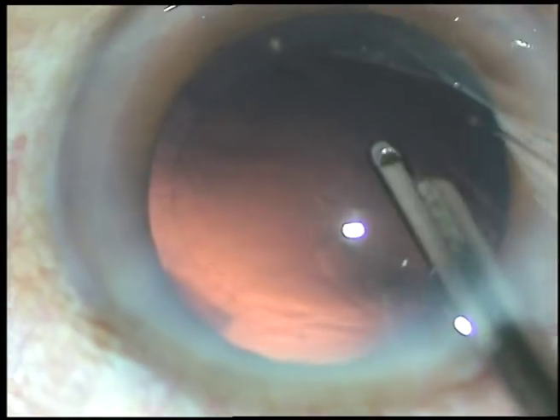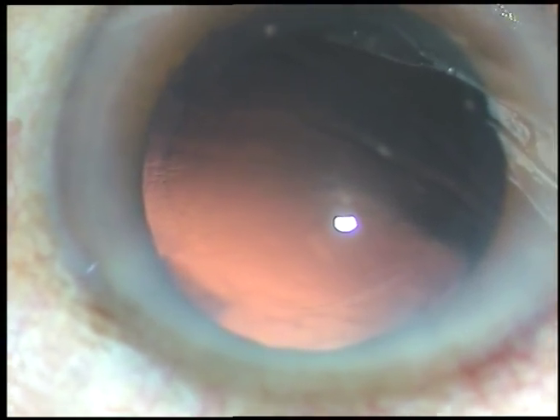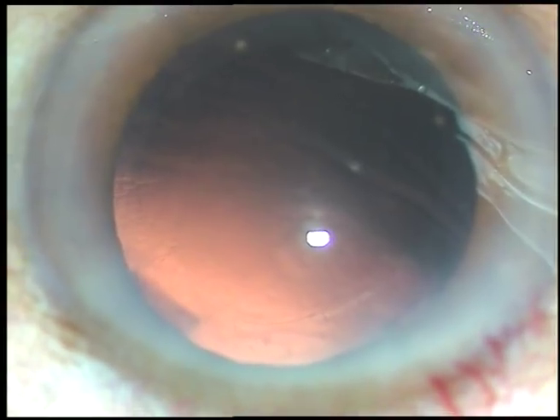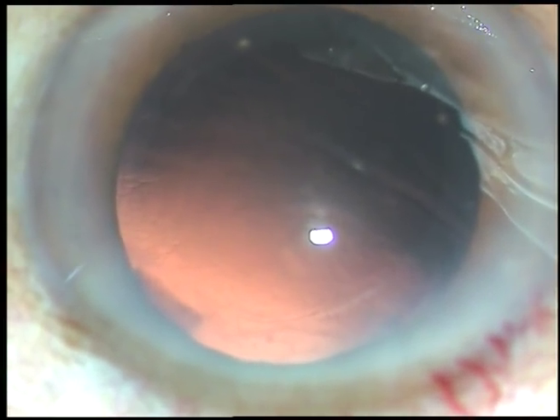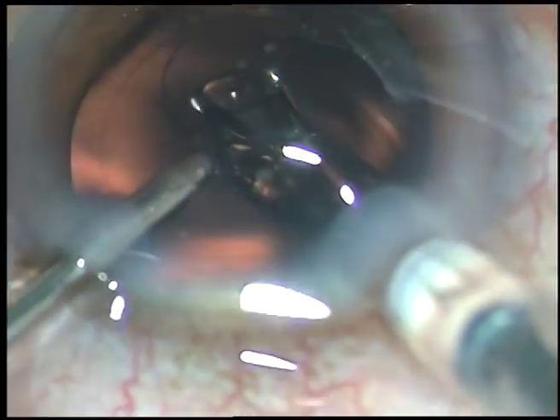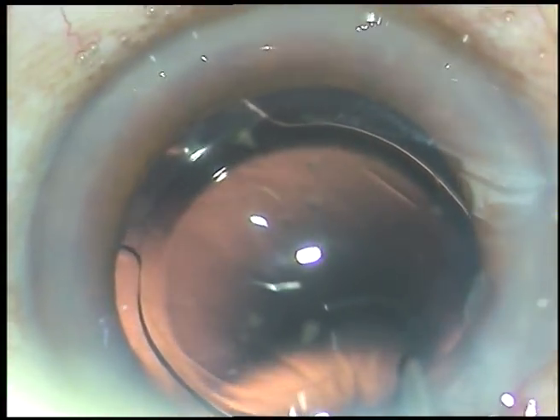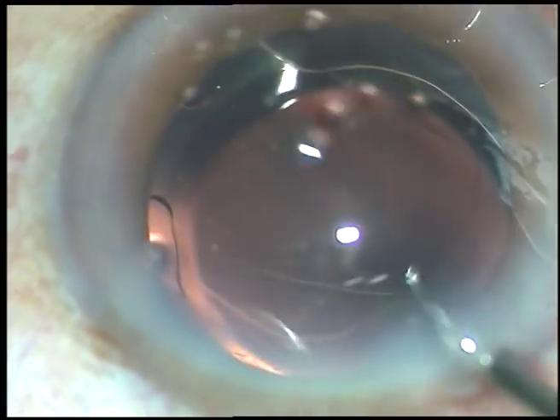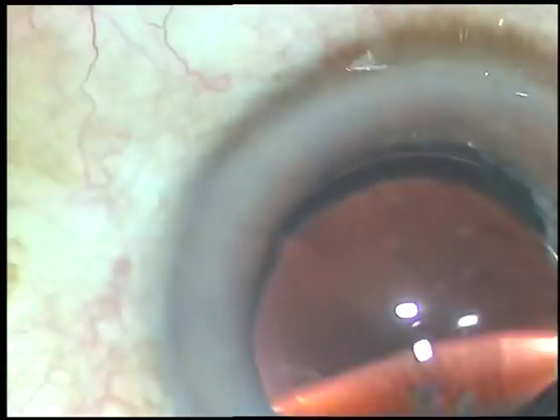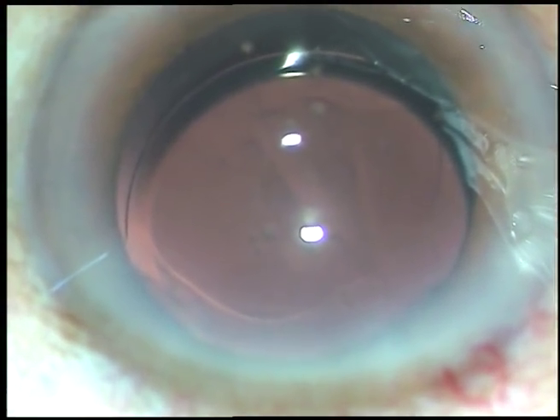Now is the time to implant an intraocular lens. This is a foldable intraocular lens being implanted under irrigation — you can call it hydro-implantation, because you are keeping the anterior chamber formed by BSS. The lens is in the bag. Dial the lens with the irrigating probe itself, and remove whatever viscoelastic substance or debris is in the lumen of the cartridge by irrigating it out.